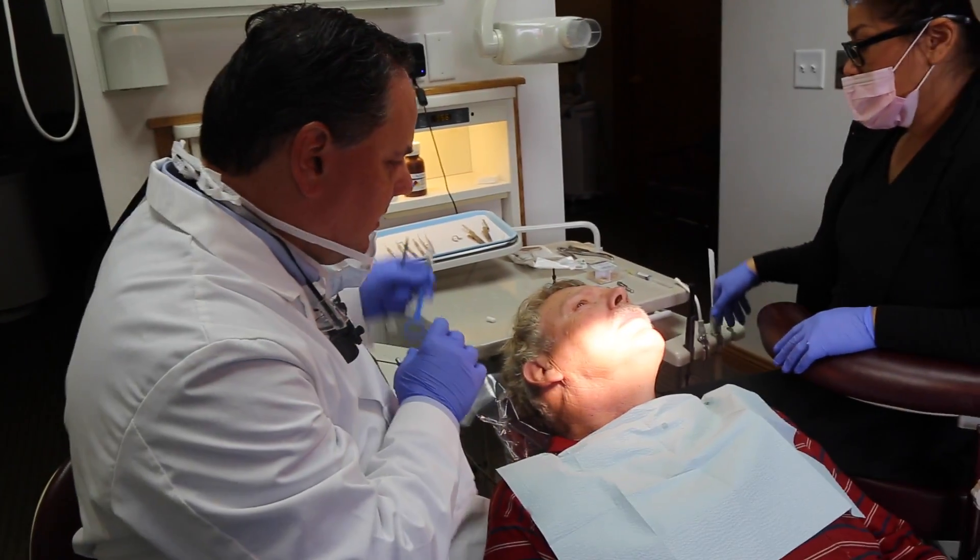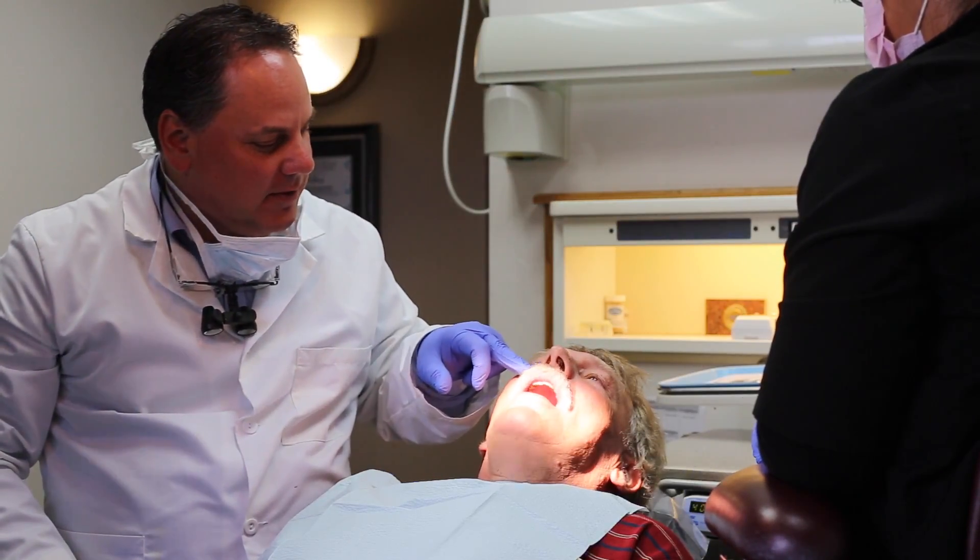Your experience with that — was that uncomfortable at all? Not at all. You did really well. Is that lip already starting to feel numb? Yeah.